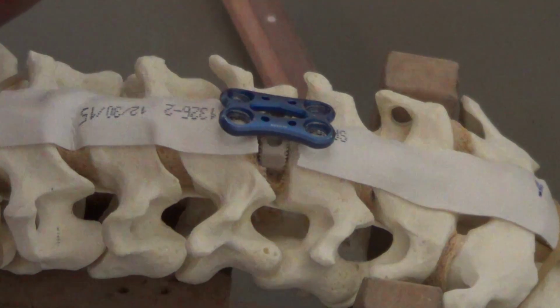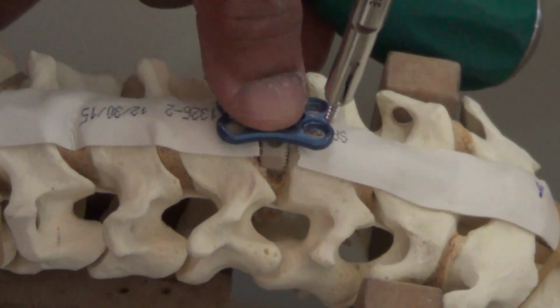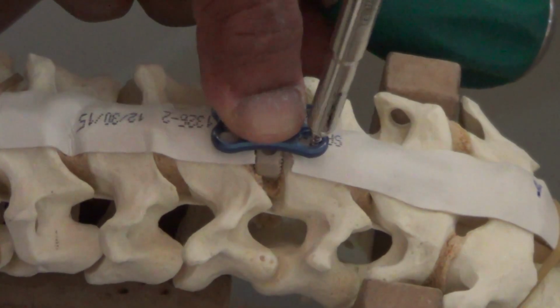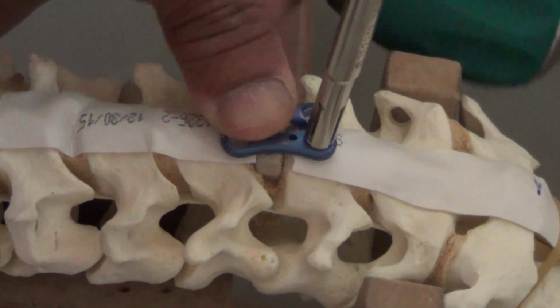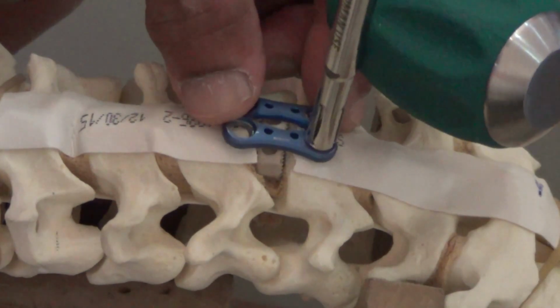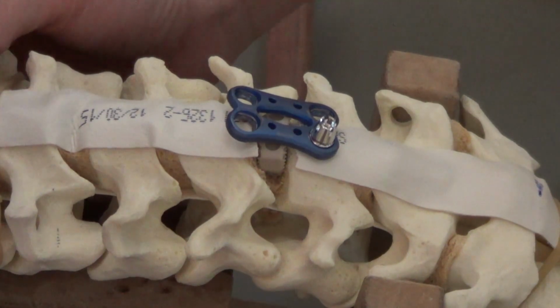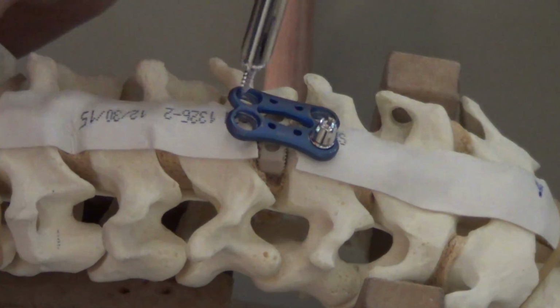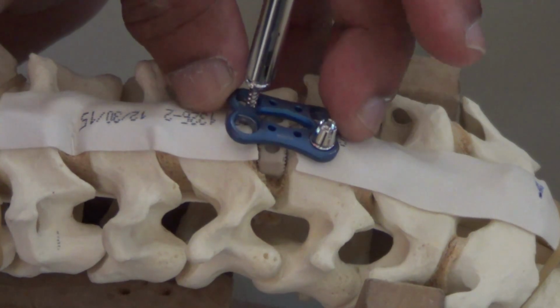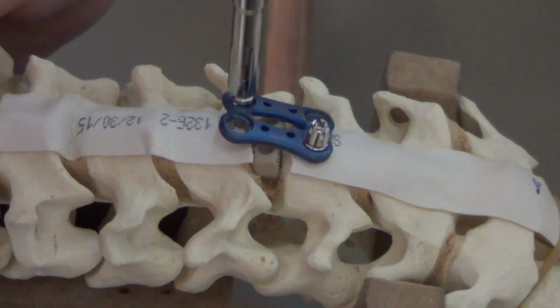So once you have left the plate there, initially you use a stabilizing pin. So you stabilize this like that. So you put one pin above and one pin below. Remember, you have already taken out your distractant pin. Now you put this stabilizing pin.